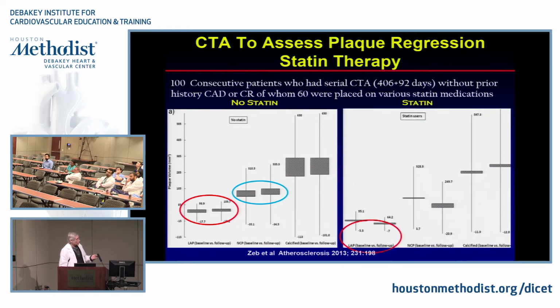In the patients who were placed on statins, there was a significant reduction in low attenuation plaque as well as total non-calcified plaque, with a slight increase in calcified plaque, and that's been described by other people as well.